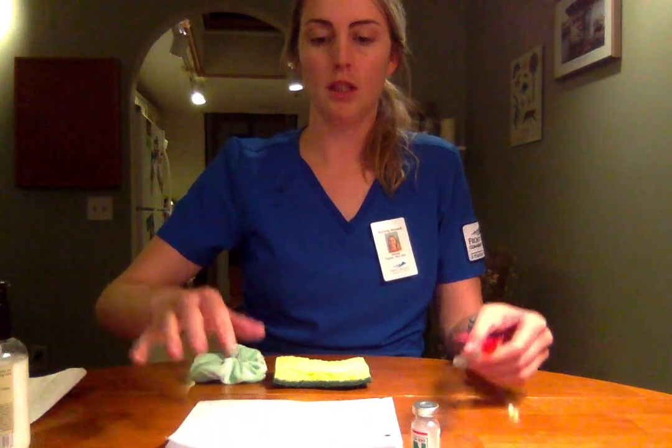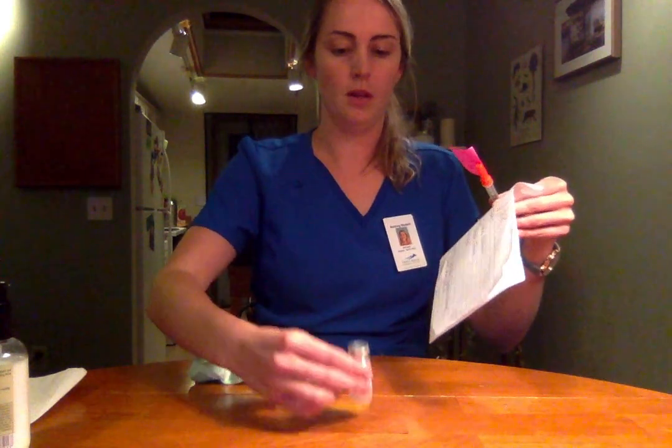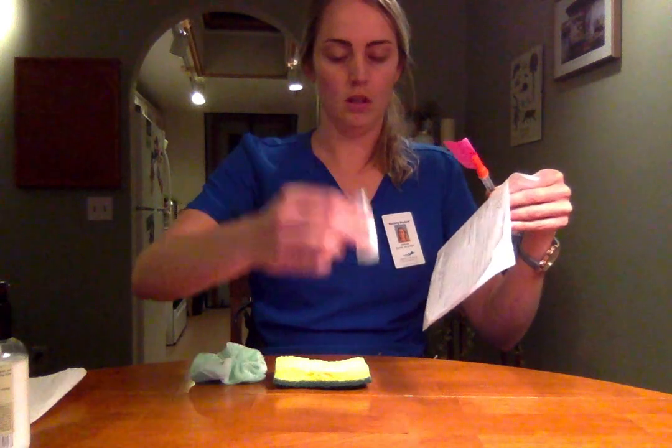Okay, now I'm going to perform my final six rights by the bedside table. And in a real life situation, I would make sure that all my supplies are at the bedside table and not on the patient's bed. So I have my MAR here, my syringe, and double checking with my vial as well. All right, I have the correct patient, Abby Abdomen, and that is what I have on here, and she also just verified for me. I have the correct drug, NPH insulin, that's what's written on here, that's what I drew up, and NPH insulin on this vial here.